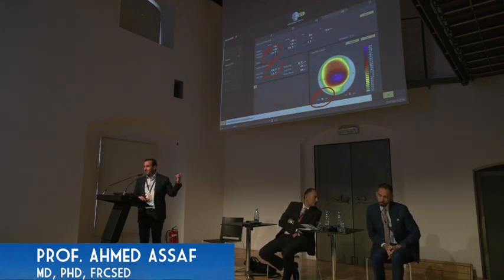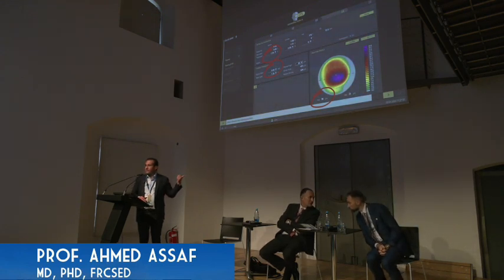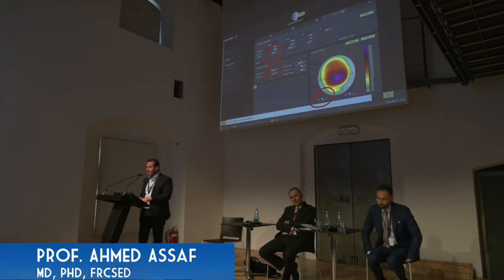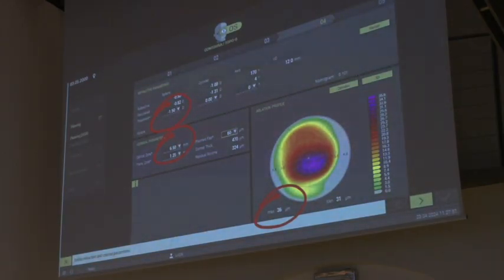And let's see here, the optic zone is 6.5, not 5.5, because I'm targeting to improve the visual quality for those patients. And what about the ablation thickness? The ablation depth is 36 microns only, because I didn't include any cylinder or any other low order aberrations for the ablation here. So let's see.